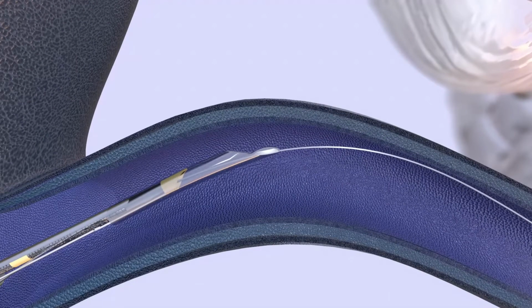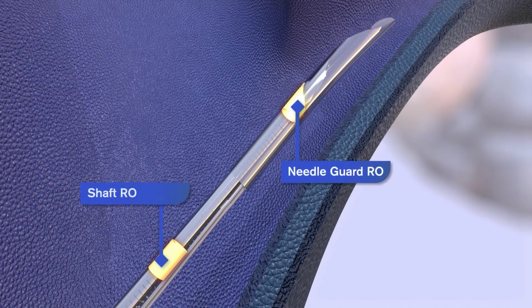Once the delivery catheter reaches the target penetration site within the IPS, the operator will confirm the positioning of the needle with imaging. A beveled RO marker is present on the needle guard and is aligned with the needle bevel prior to needle guard retraction. This enables visualization of needle orientation under fluoroscopic guidance. An RO marker is also present on the delivery catheter shaft, proximal to the needle.